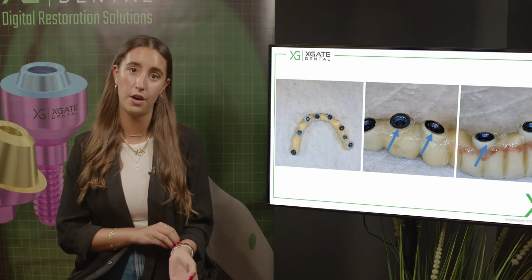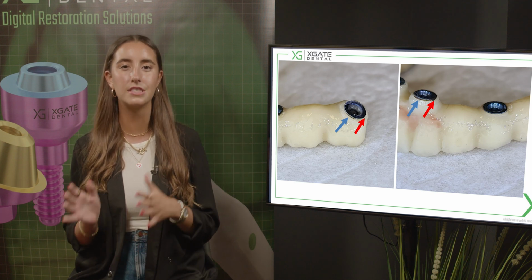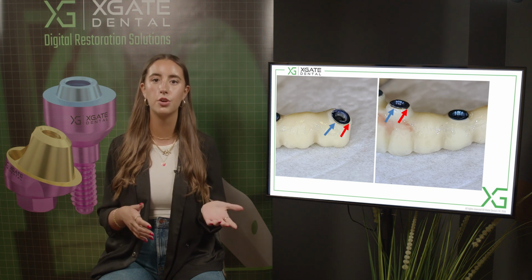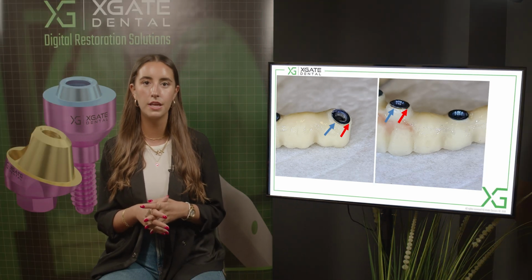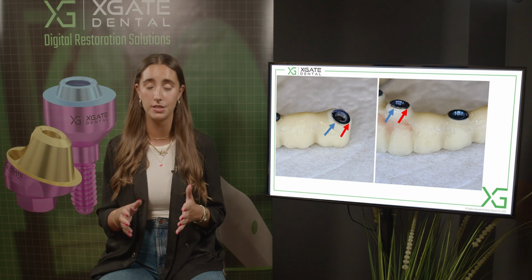One is higher than the other. And here you see that you have a very small slot between the sleeve and the zirconia bridge. Right now you can take composite material, flowable liquid composite material, just close it up and polish it. So we just added some material here to close it, and this way you don't have any gaps for bacteria or different types of organisms.